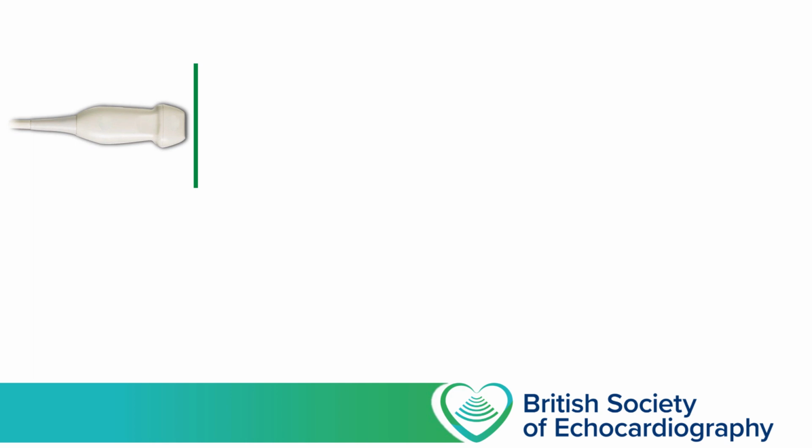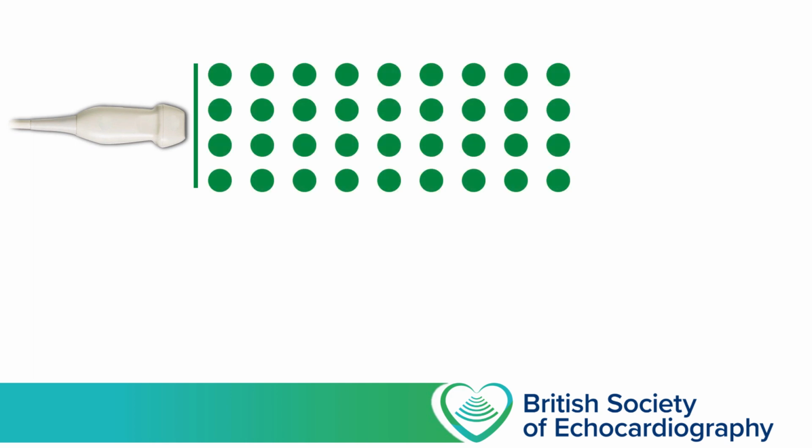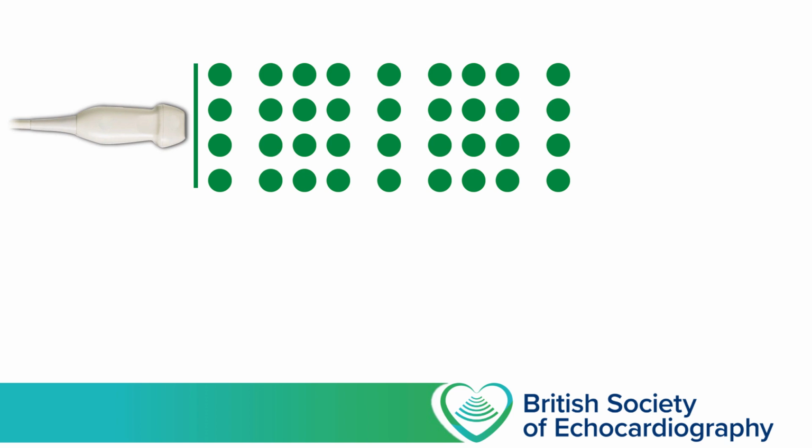Let's hold our probe against the patient's skin, and initially all of the particles in the patient we can imagine as being evenly spread apart. Now as we start to generate a wave of kinetic energy, we're going to push those particles. We push some closer together, and because we can neither create nor destroy any particles, inevitably we end up with areas where some of the particles are spread further apart than they were at rest. Areas where we've pushed the particles close together we call areas of compression, and areas where the particles have been spread apart we call areas of rarefaction.